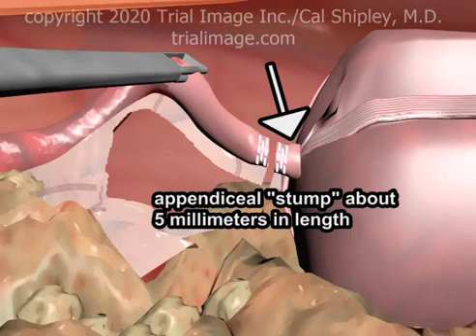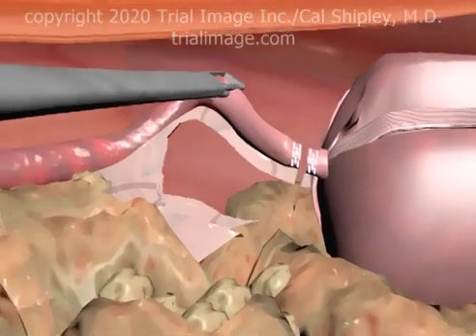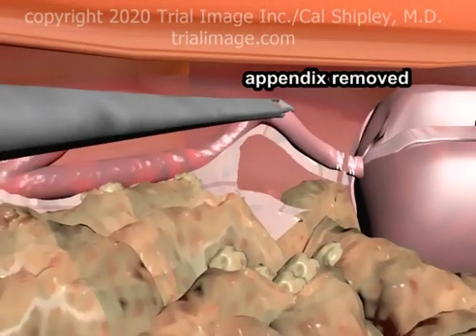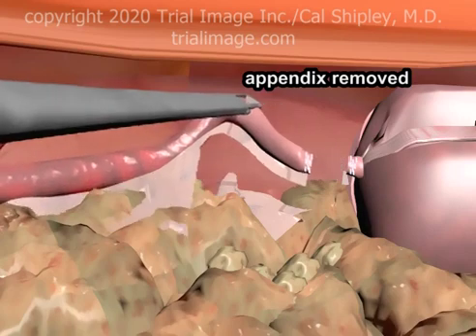The remaining appendiceal stump is about 5 millimeters in length. The infected appendix is now free of all attachments and may be removed.